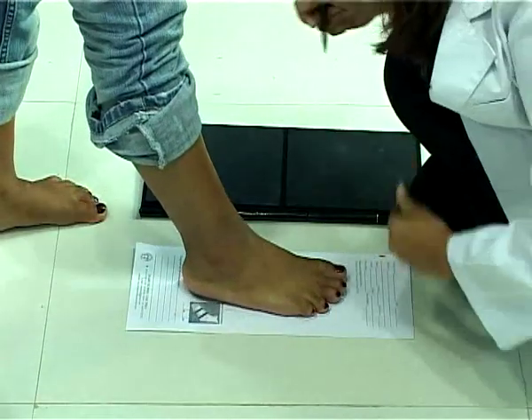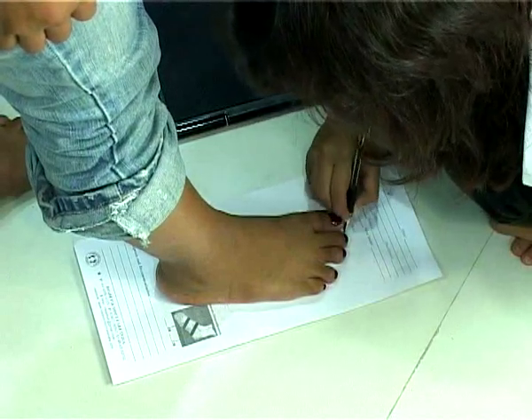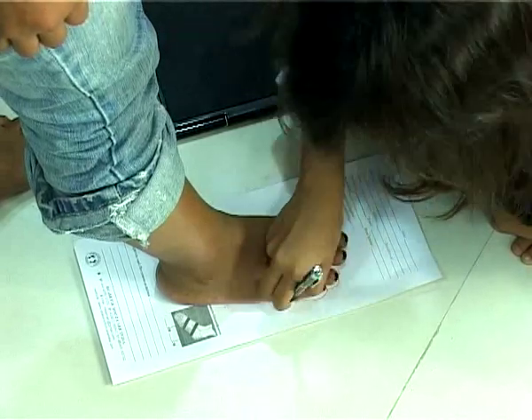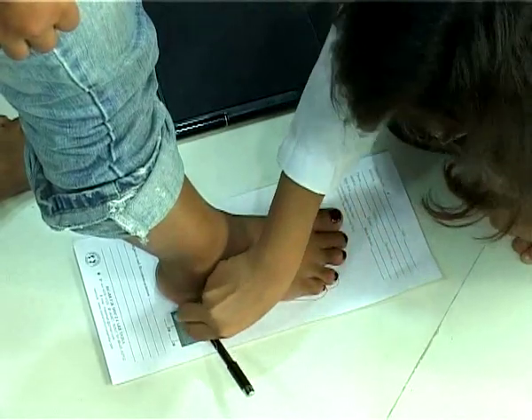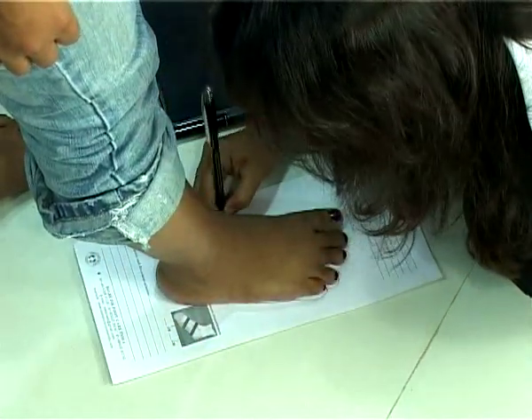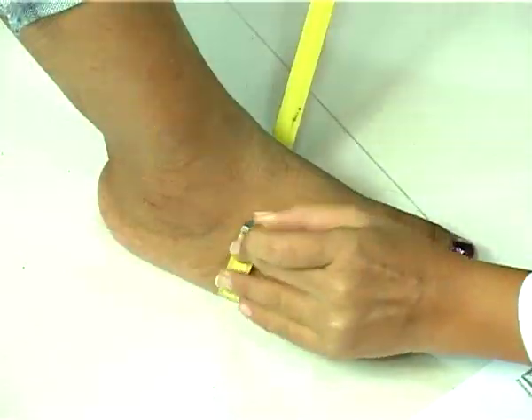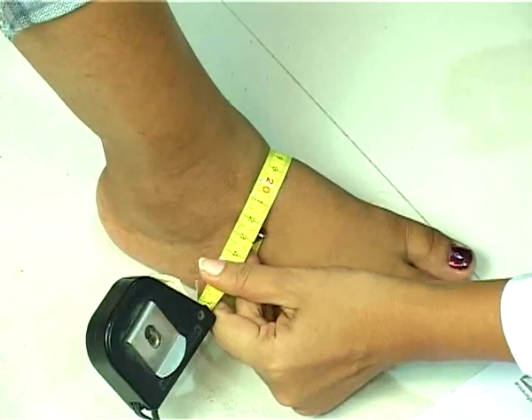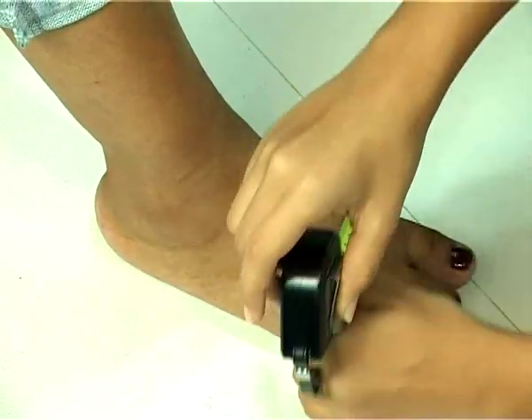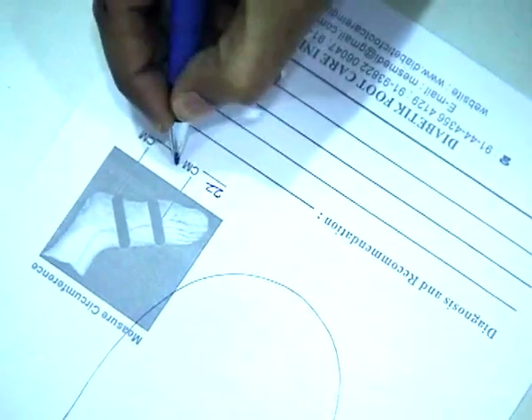Allow the ink to dry and ask the patient to keep the foot on the reverse side of the paper and mark the outline. Measure the circumference of the foot for making a fitting shoe.